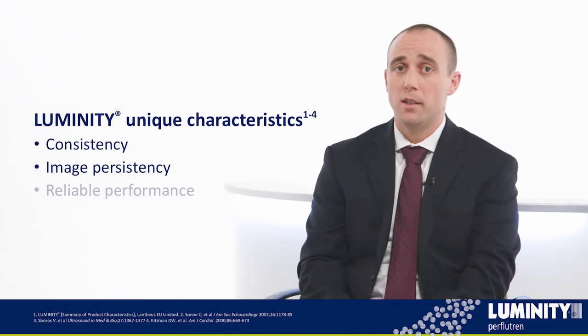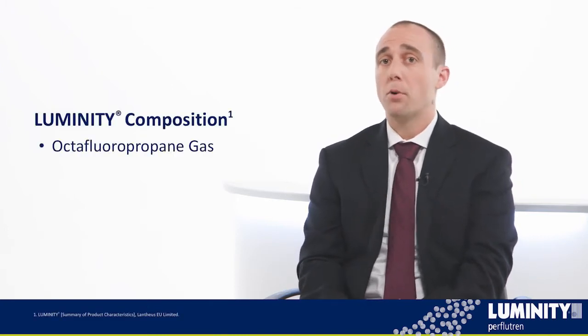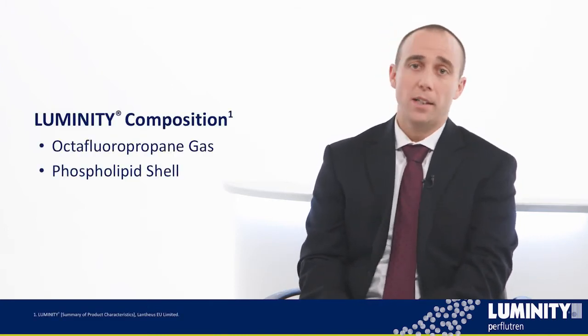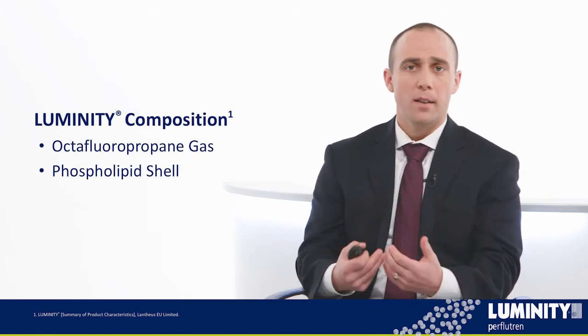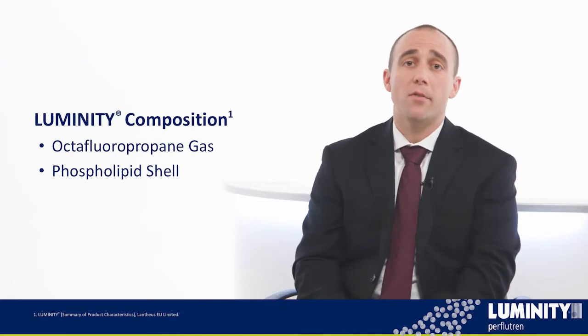Luminity has unique characteristics that contribute to the consistency, image persistency, and performance that we achieve with Luminity. The composition of the Luminity microbubble is unique. It's composed of an octafluoropropane gas with a phospholipid shell. Now, these phospholipids are an important component as this significantly affects how the microbubbles perform.